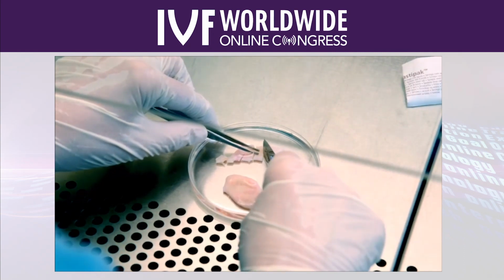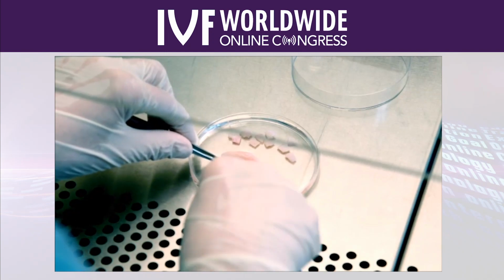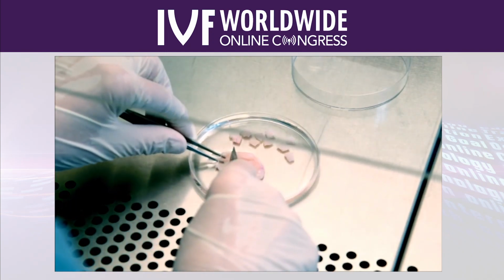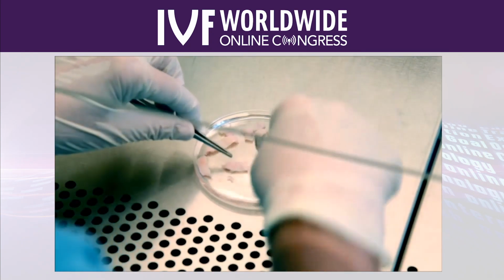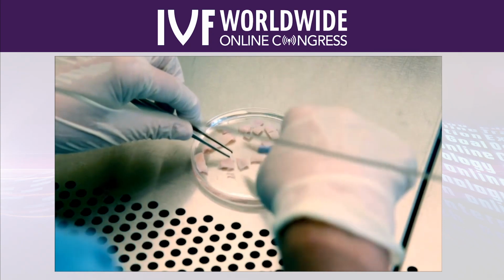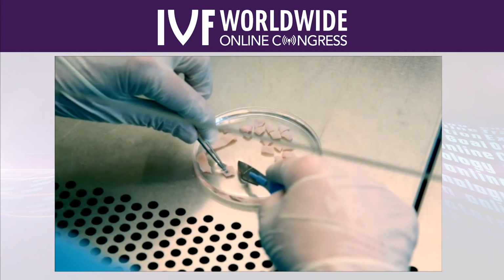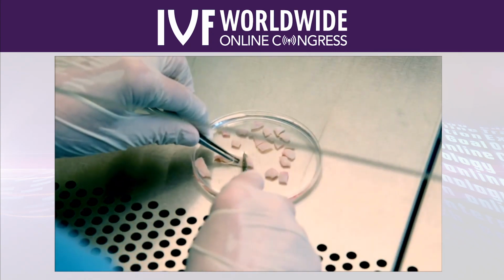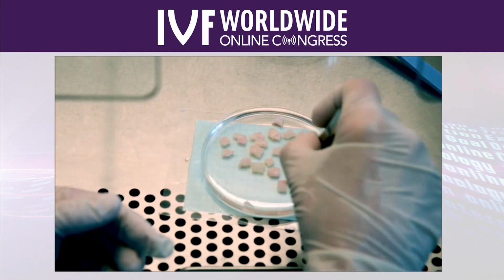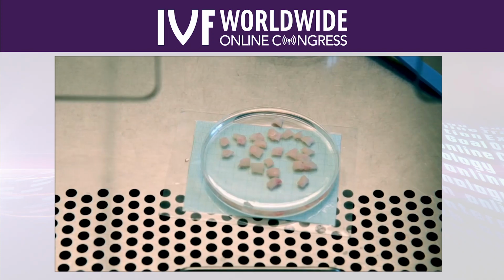And here you can see we're then cutting it into smaller pieces. And we normally try and make 20 to 25 pieces to fit into 20 cryovials. But it of course depends on the size of the ovary. And then afterwards we line up the pieces, then we take a picture in order to document the size and the number of pieces.